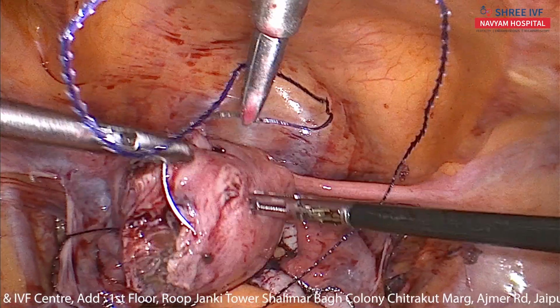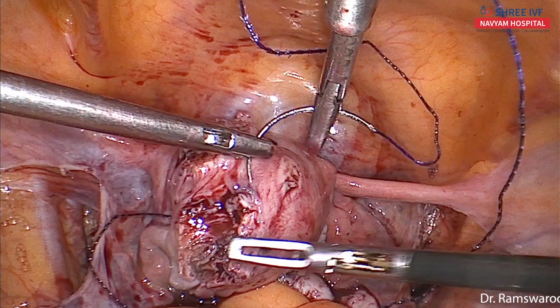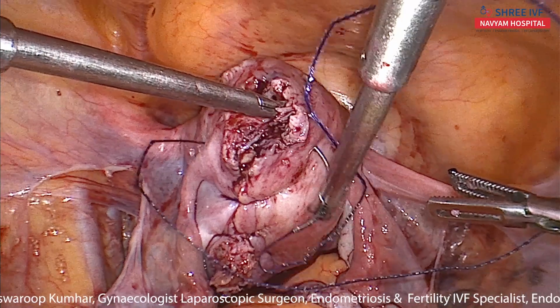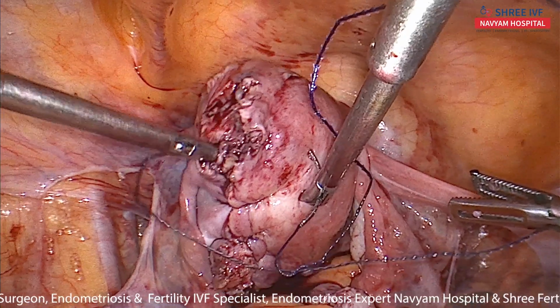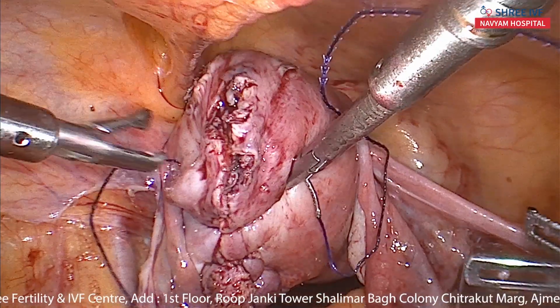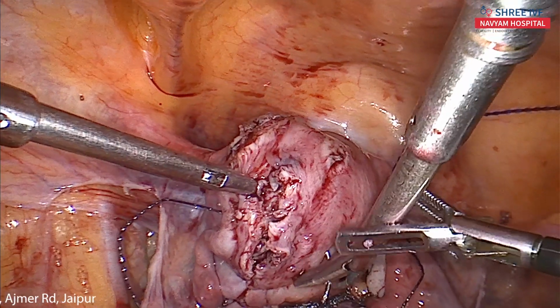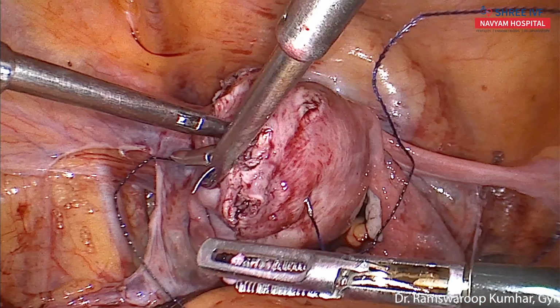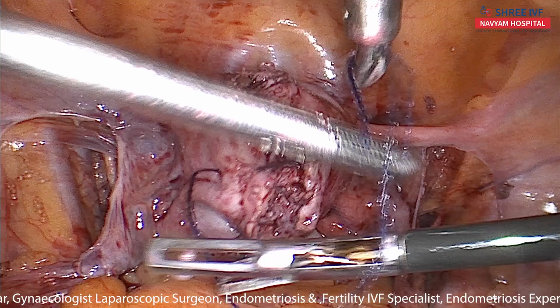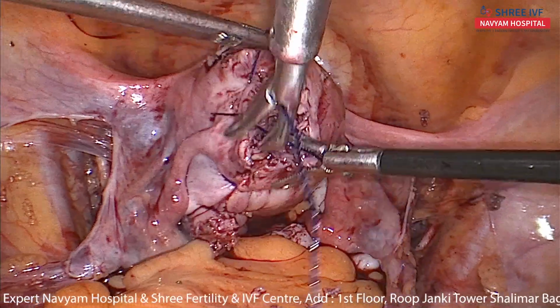Now morcellator ready. Thank you, Sunil. No, sir, everything is fine. Yes. I'm not talking about the anesthesia part. I'm talking about the surgical part. Please guide. Any input you want to give? We are not worried about the anesthesia part because you are here, the excellent person. We are worried about the surgical part only.